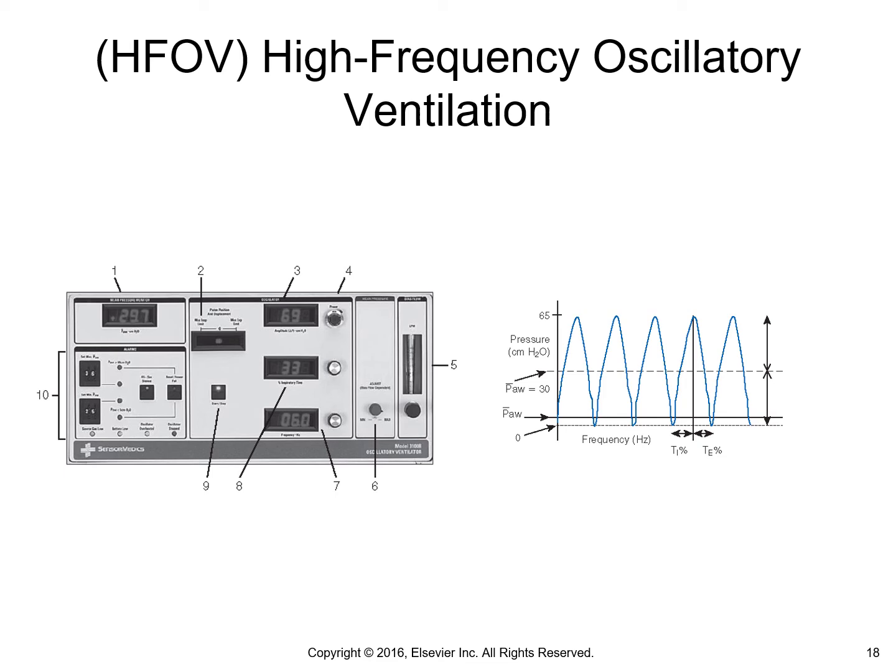The pressure is positive in the airway during the inspiratory phase, during the forward stroke of the piston. If you think about it, it's like an old speaker. It has a diaphragm-shaped piston that is magnetically driven, like a stereo speaker, like the old stereo speakers where you saw the big circle inside of them.